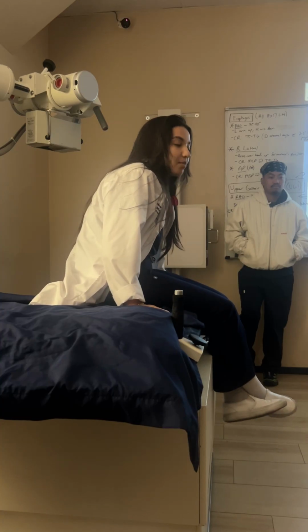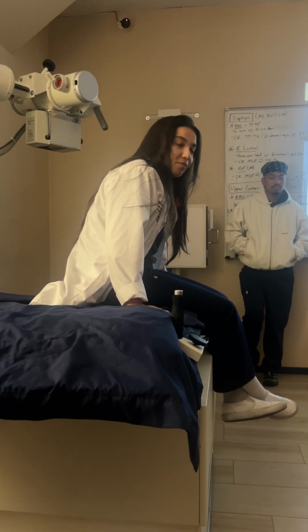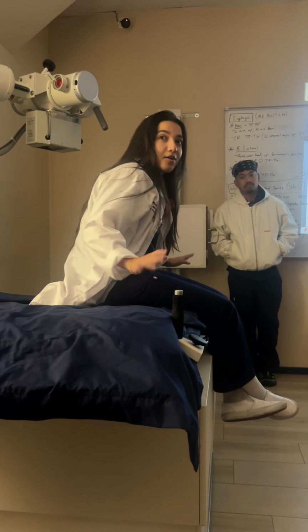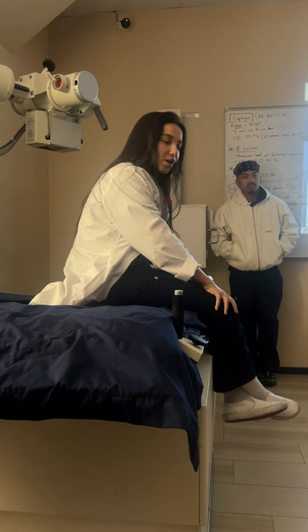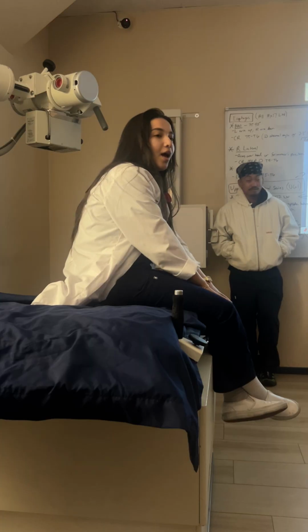I tell them that it's going to be a little bit of pressure in the beginning, but I'm going to be right here with you. It should be only about a 15-minute procedure once the doctor comes in. And then once we take that out, you're going to feel so much relief. They get really happy once it's out. Then everything is out, so they feel so much better. Usually they're coming in because they're constipated or because they haven't pooped in a week, or more than a week, so they're going to feel really good. It's all going to be out.